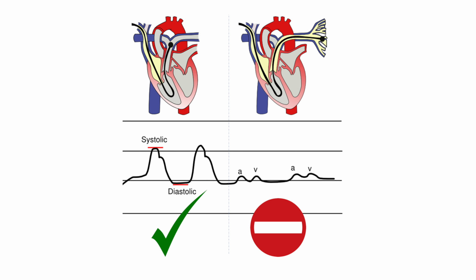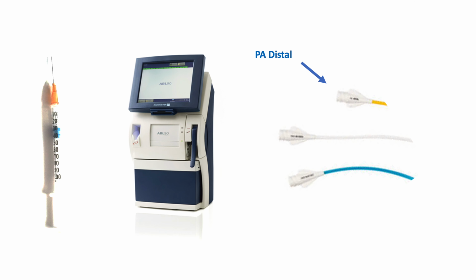To connect and collect continuous venous oximetry data, what you will need to do is perform a blood draw from the distal end of the catheter lying in the pulmonary artery. You should therefore take a blood gas from the yellow lumen, so take 10 mils of waste blood and then a small sample using a blood gas syringe, which should be processed using a standard analyzer.